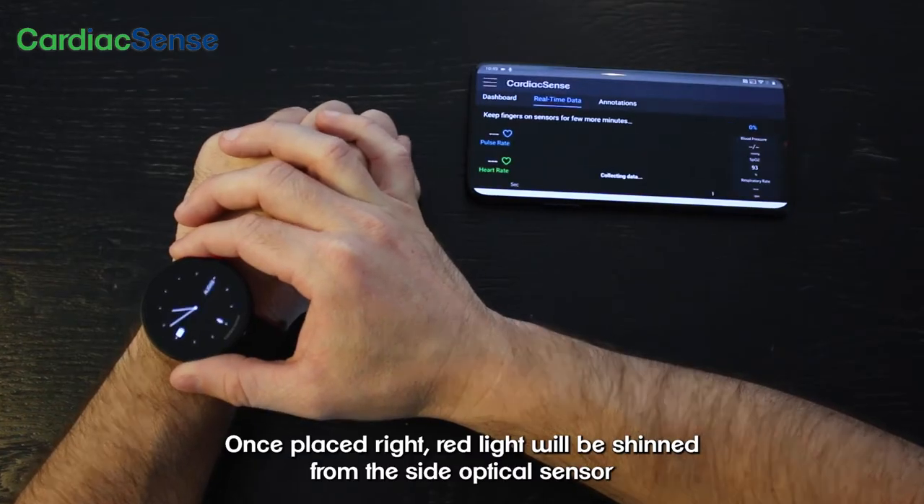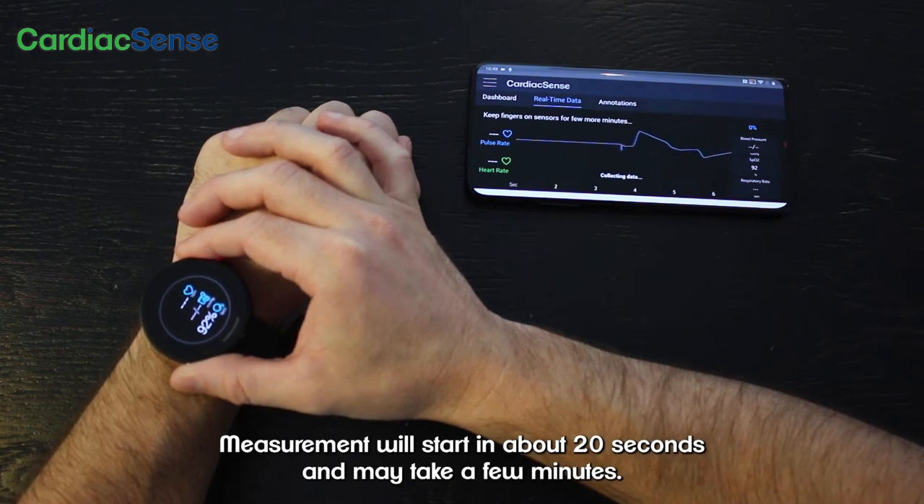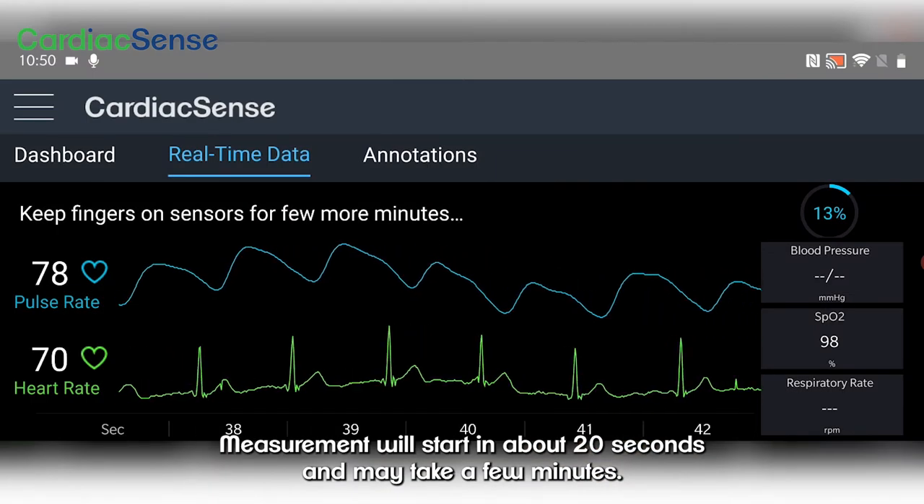Once placed right, red light will be shined from the side optical sensor. Measurement will start in about 20 seconds and may take a few minutes.